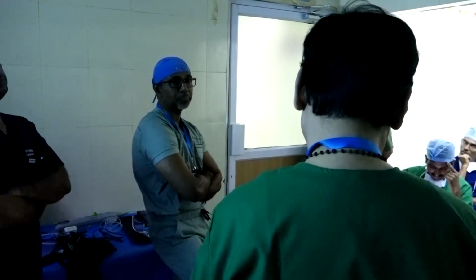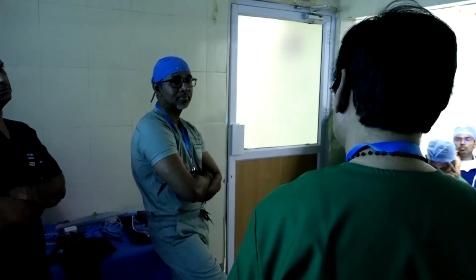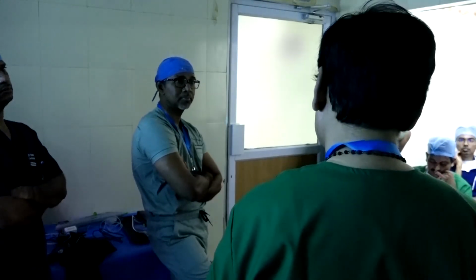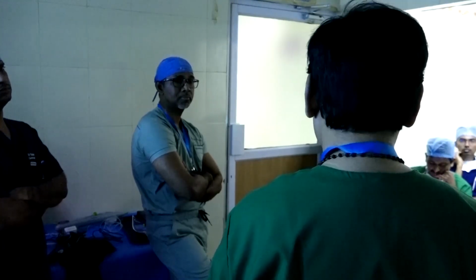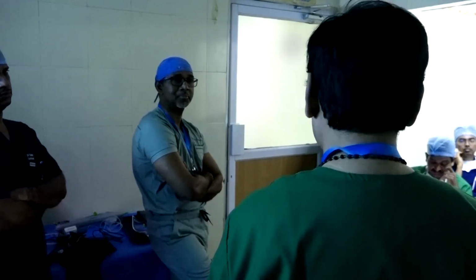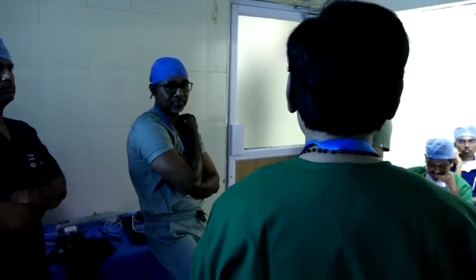Especially fibrotic lesions, laser is very useful. In ISR with fibrotic lesions, laser is very, very useful. In calcific lesions, IVL is very useful. In the good olden days there was rota, but rota is unsafe. What I have seen, you can do it heroically, but suddenly it will give way, because it is highly resistant.